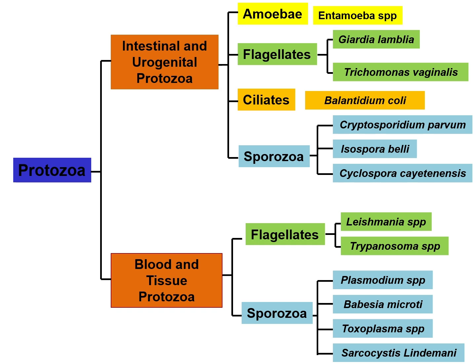We talked about sporozoa, and mostly we discussed Toxoplasma gondii in my session, and I'm sure Dr. Awar covered Plasmodia species. Knowing that other blood and tissue sporozoa may include Babesia microti and Sarcocystis lindemani.